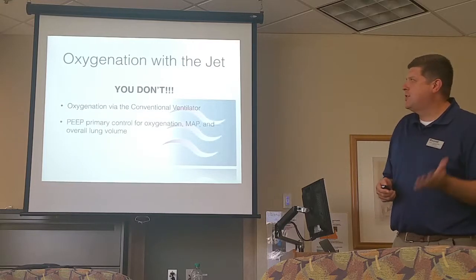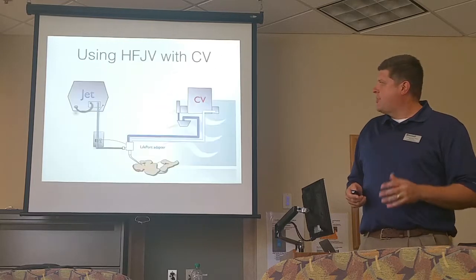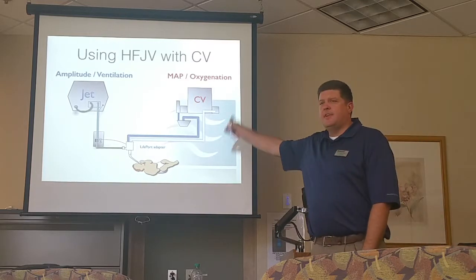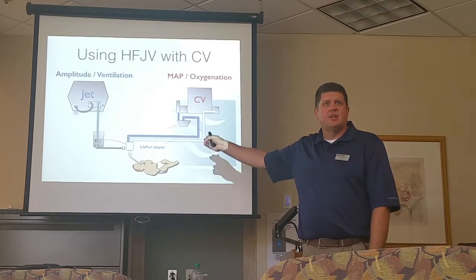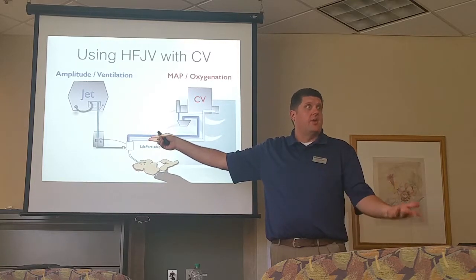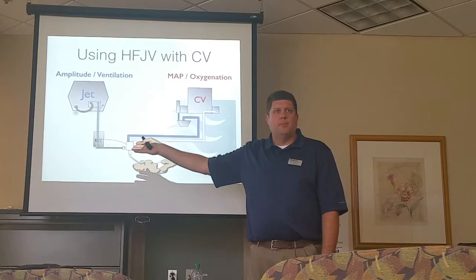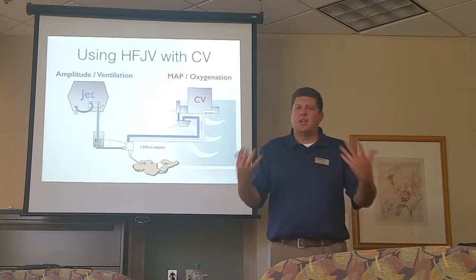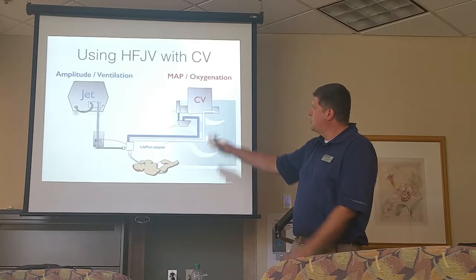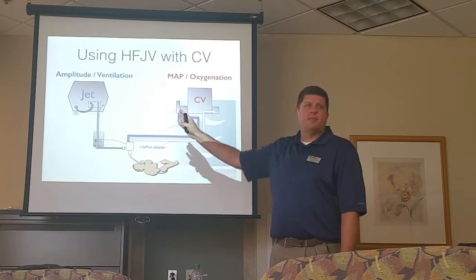And so even though you have two ventilators at the bedside, a conventional and a jet, separate the two, because they do two totally different things. All the conventional does is oxygenation, okay? The jet is a ventilator in the pure sense of the word ventilator. It blows off CO2. So if you have a CO2 problem, we're going to touch the jet. If you have an oxygenation or lung volume problem, we're going to touch the conventional. And so even though I've got these two at the bedside, draw a line between the two. They do two completely different things, but really simplify it.